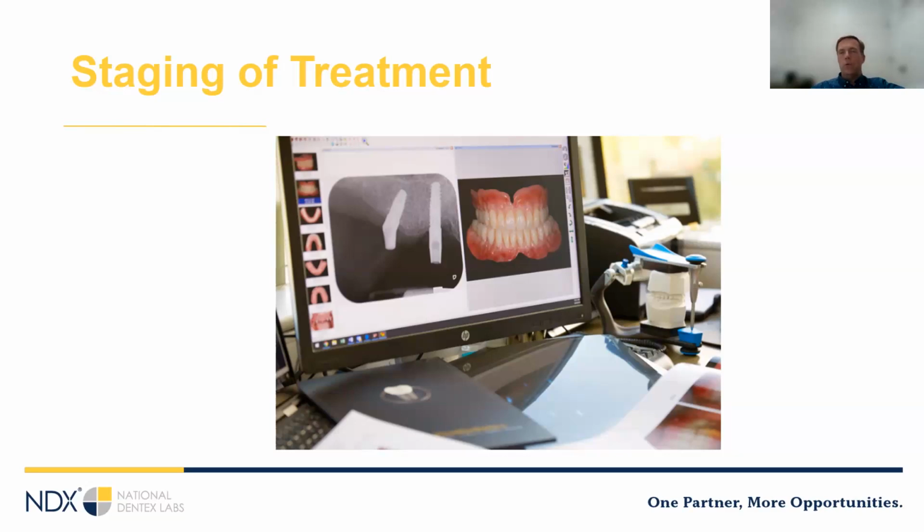Let's talk about an upper full arch case done in 3 segments. Let's say we do 2 to 5, 6 through 11, and 12 through 15. So you look at the case and you tell the patient, okay, I can get your 6 front teeth all looking the same in the ideal position, but there may be a little bit of space between them and your back teeth, and I need to build up your bite a little bit.